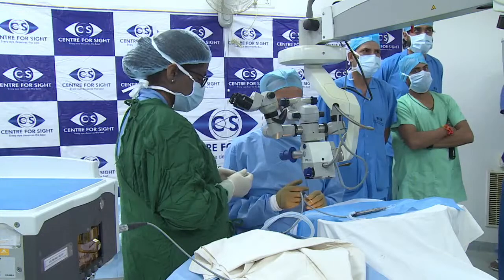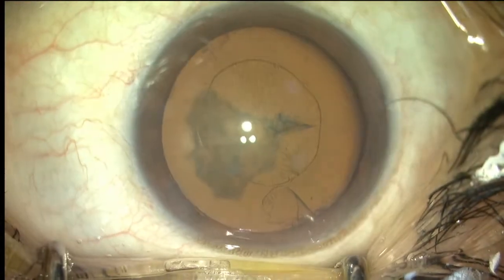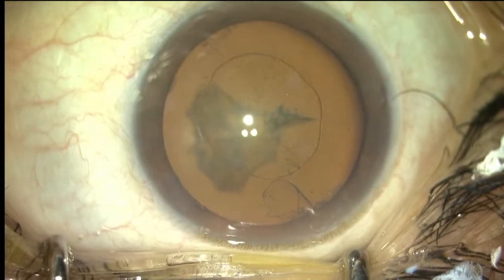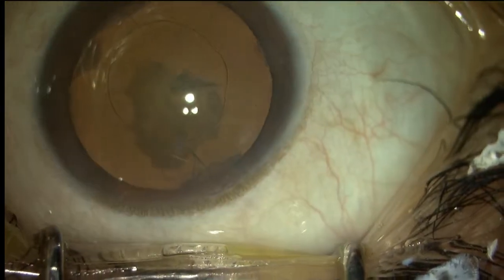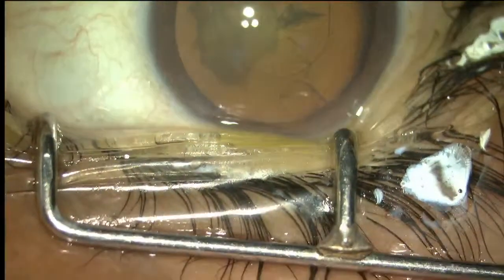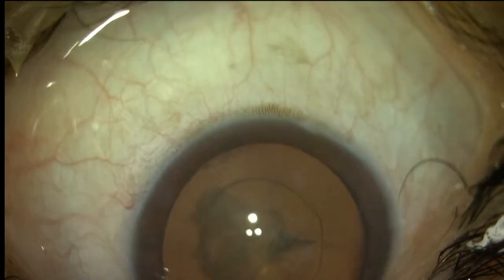Posterior subcapsular cataract you can see here, and it's not very hard, grade 1 or grade 2 nucleus. Shift the screen, brother. And I have already done the capsulorhexis for this patient, and I am going to do the hydrodissection.